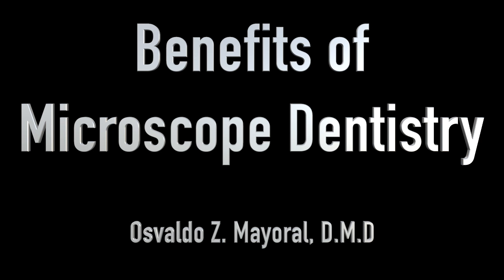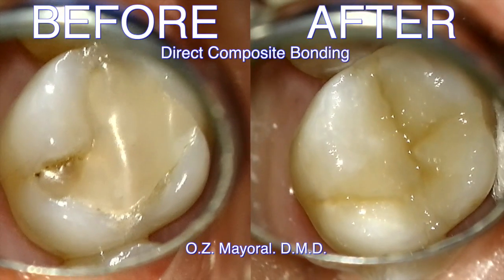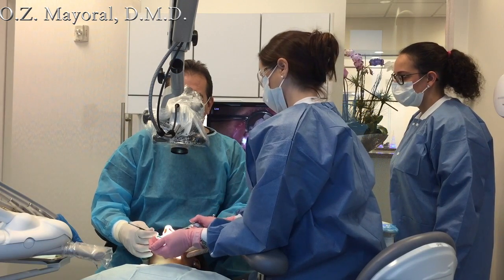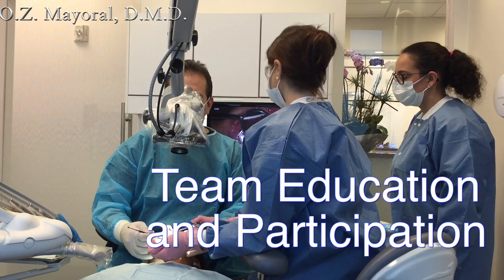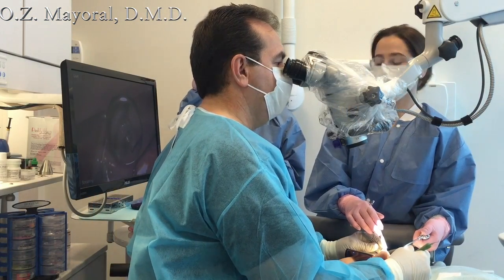We're going to get ready to cure, trim, and polish, and we'll be done in no time. Let's make sure the ceiling monitor is up and running and that we're recording the procedure, please.